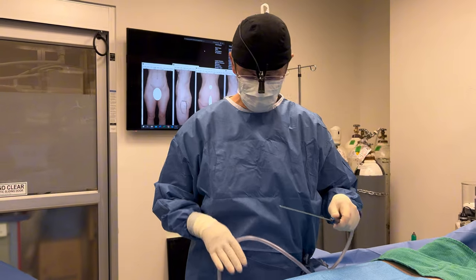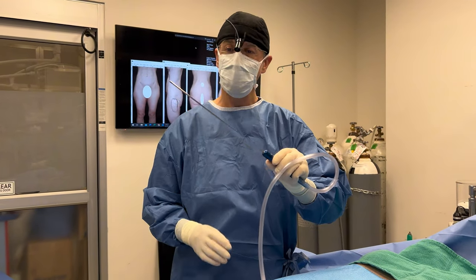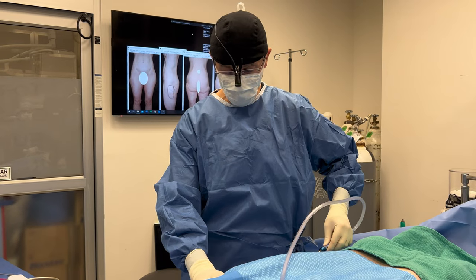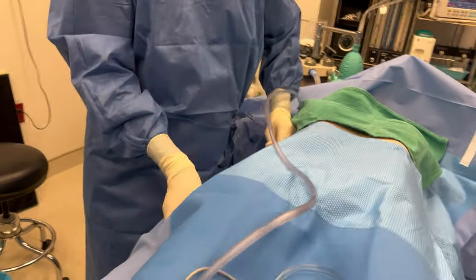For this procedure I've infiltrated the area with tumescent solution — standard for all liposuction. I'm using a very, very fine cannula. I'm going to do very gentle lipo. This is not a large volume; this is a very, very small volume.